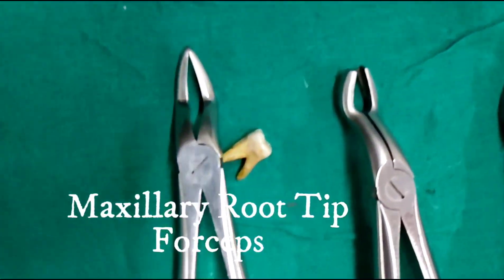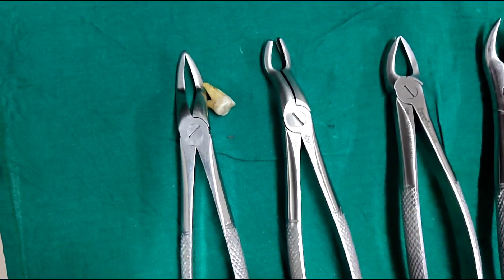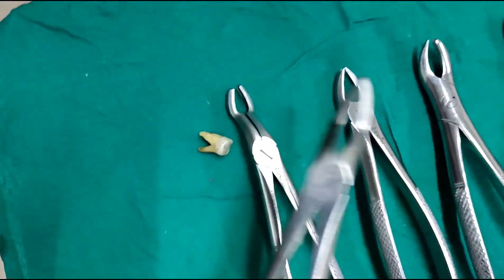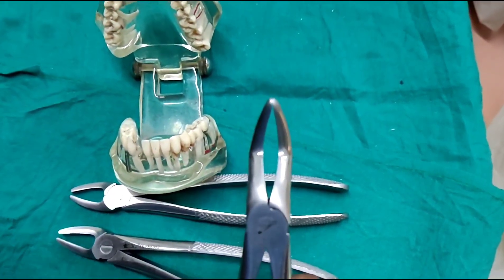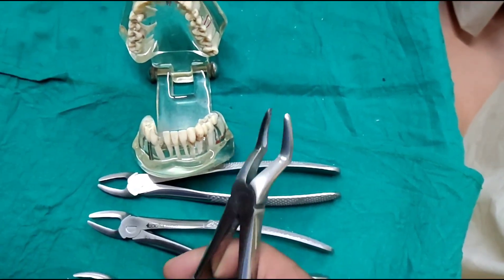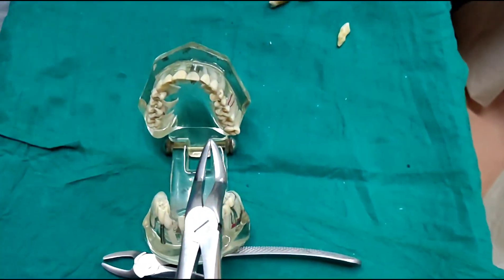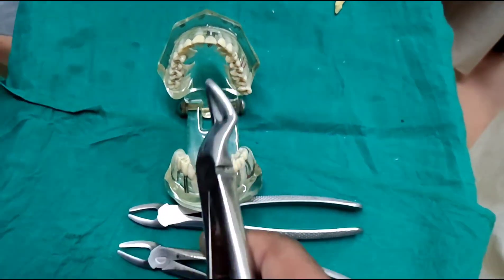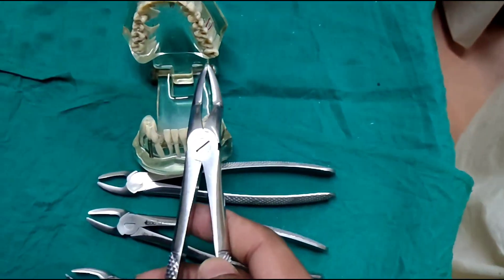This is the root tip forceps, or root forceps. These are used to extract broken roots or broken tips. The beaks of the root tip forceps meet each other, which gives grip to engage root tips that are very narrow or thin. This can be used to extract the root tips of anteriors, premolars, molars, or third molars — any root in particular.